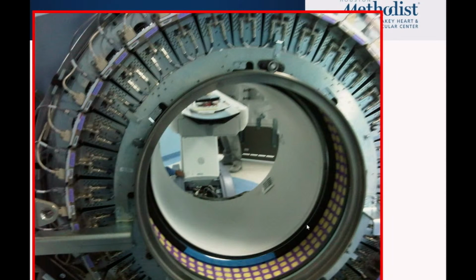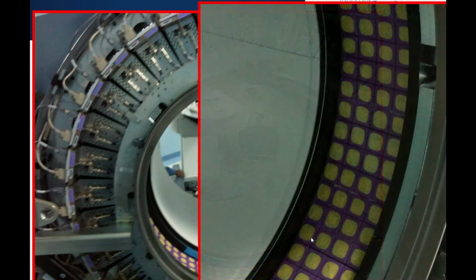We're going to dig deep into the anatomy of this machine. If you look here, you have the PET detectors, the different rows. I'm going to quickly zoom in on them, and you'll see different rows of the PET machine. Each one of them is a different PET unit, or PET detectors, and I'm going to take you through the depth of each one of them, what's behind these PET units. Each one of these they usually call rings in the PET industry.